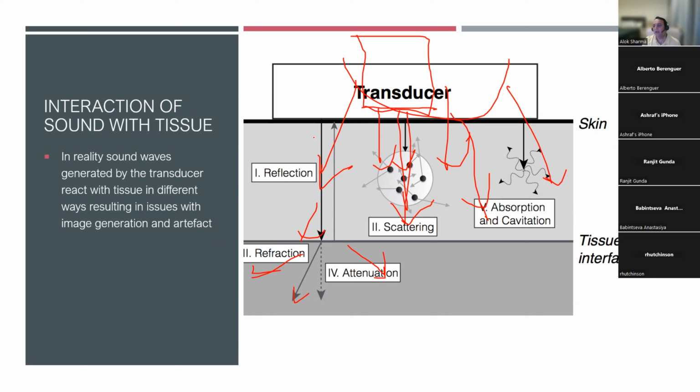But again, you can see how the nature of the probe is going to interact with the tissue underlying you to give you images that can vary. Not only do they vary, but they can affect your interpretation. And that's why it's very important that you understand the fallacies of using different probes, something that we will discuss a lot when you're doing your peer review.